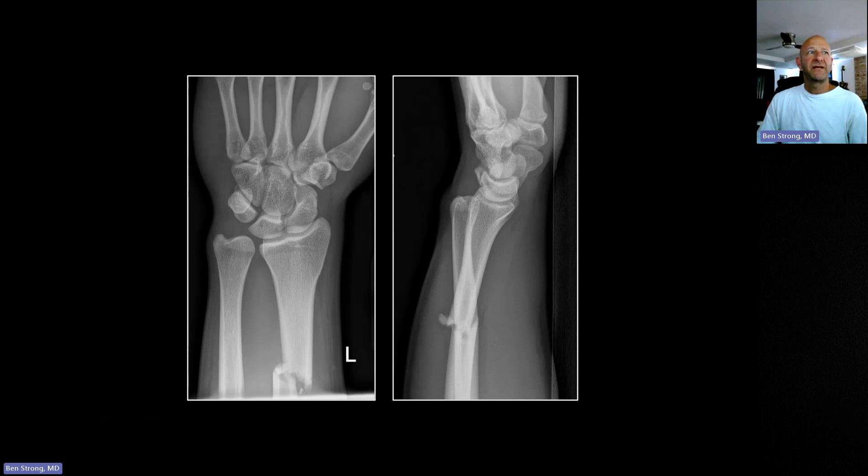Moving to hand and wrist, the Galeazzi fracture is the opposite of the Monteggia fracture. Monteggia is an ulnar fracture with radial head dislocation; Galeazzi is a fracture of the radius with dislocation of the distal ulna. On the frontal it may look like just a radius fracture, but the distal radioulnar joint is clearly too wide. On the lateral the distal ulna is completely displaced posteriorly, which is hard to appreciate on the frontal.